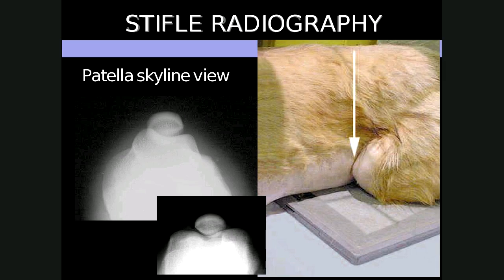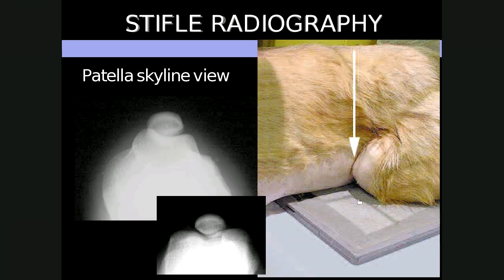Another view we sometimes take of the stifle to look at the patella is the patella skyline view. The correct term is the cranio-proximal to cranio-distal oblique, because the beam remains cranially on the stifle but goes from proximal to distal. It is good for assessing the depth of the trochlear groove as well as the location of the patella in cases of patella luxation, and is especially useful in the equine patient for patella trauma. Here's the patella sitting nicely in the trochlear groove with the trochlear ridges medially and laterally of the distal femur.